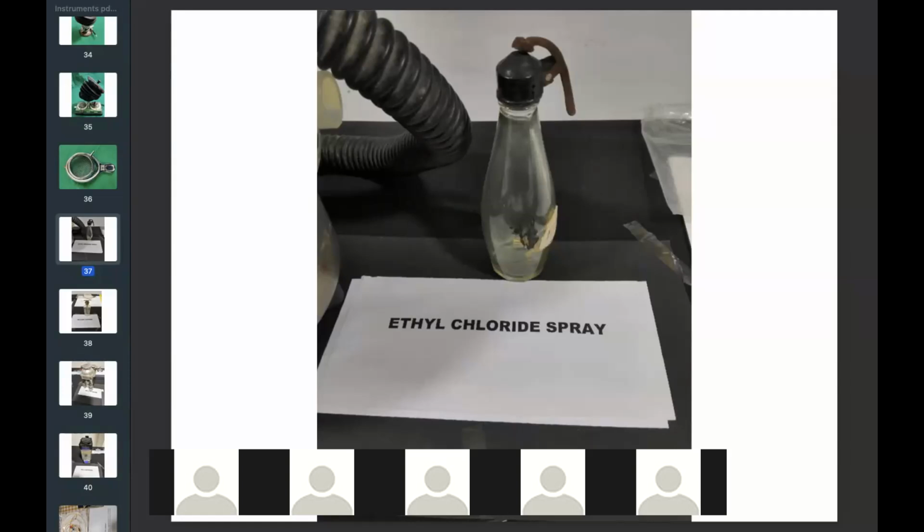And at a particular stage, I don't remember exactly which stage, you switch over to ether. I think Madam Dhaigude can tell which stage you switch over to ether from ethyl chloride. Stages of anesthesia, 1, 2. I think stage 2, phase 1 or 2, you switch over to ether, where the patient starts breathing regularly. Asleep. You see the eyelash reflex. Once it is asleep, you switch over to ether, and ether you will be pouring. Can you show the next slide?